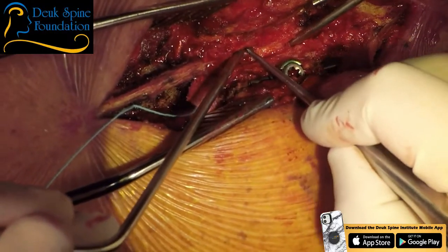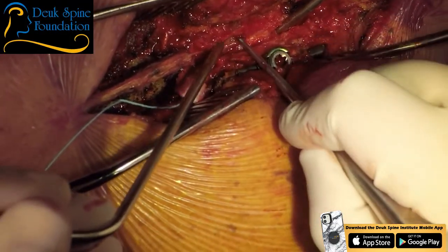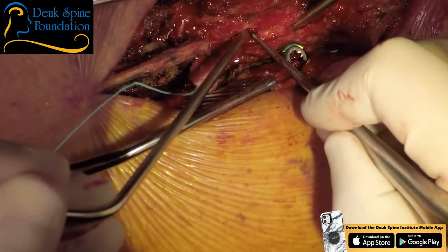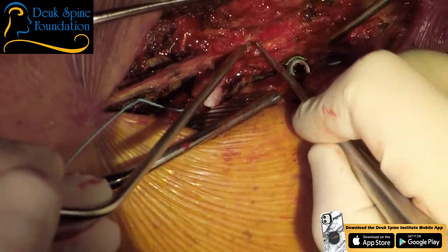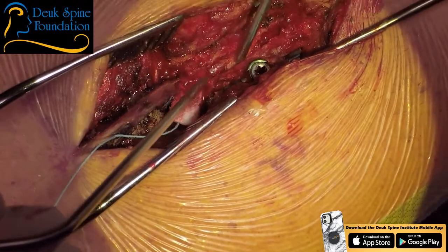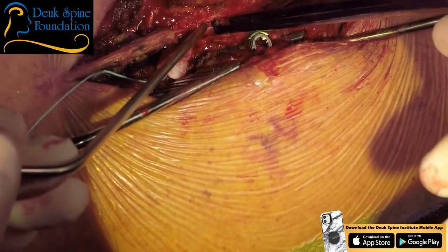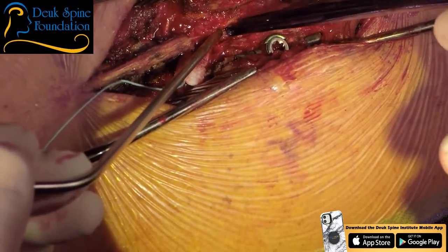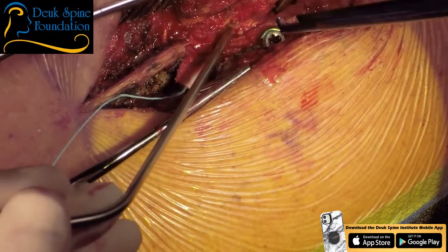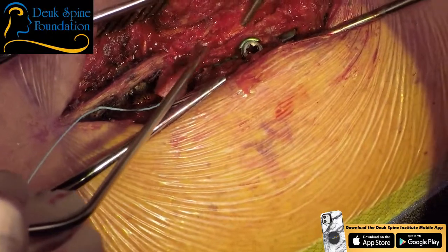I'm right above the spinal cord, and I feel like the spinal cord is sticking here to the bottom of the lamina. So I can't just bite the lamina off unless I want to get a spinal cord injury, which I don't. So you have to first separate the dura from the bottom of the lamina. Let me have a 2.